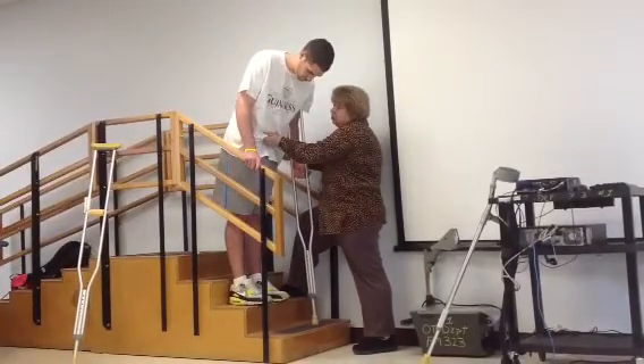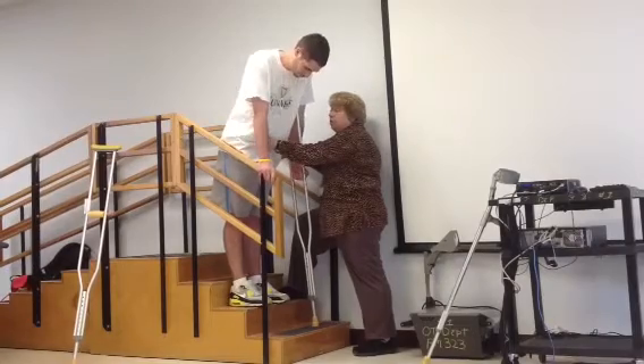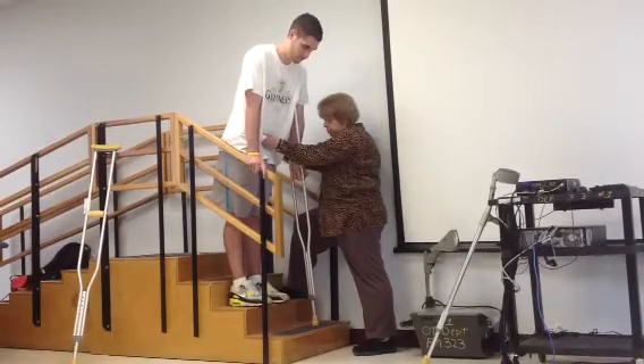You're going to put the crutch down, lean on to the banister, and then what you're going to do is do a push up and then look up to bring your legs forward.